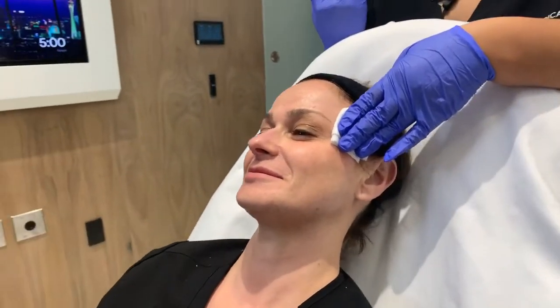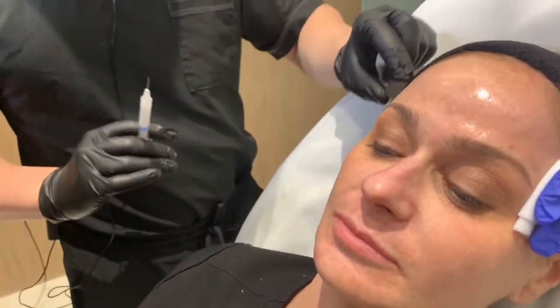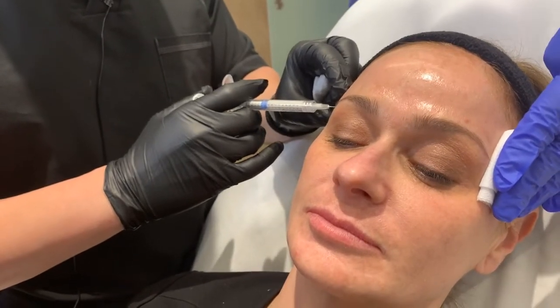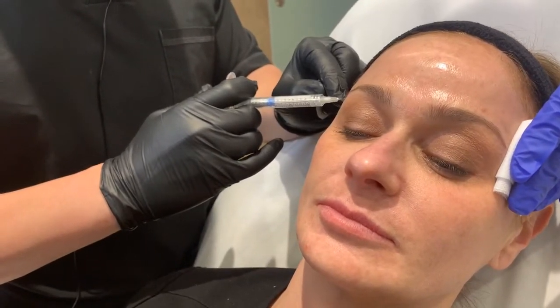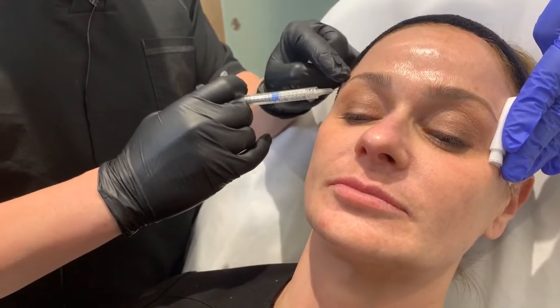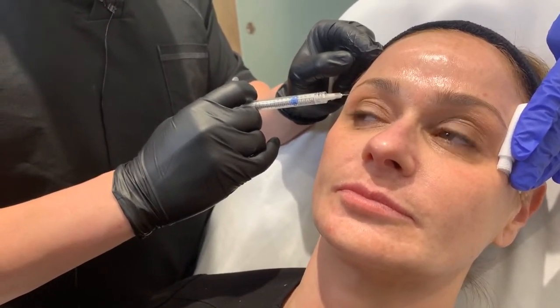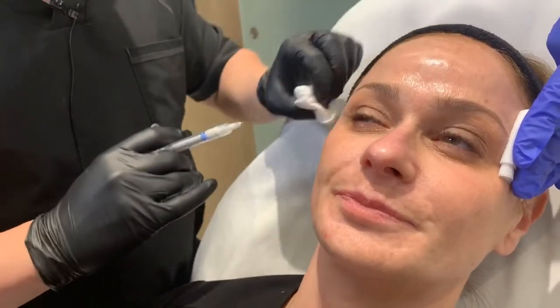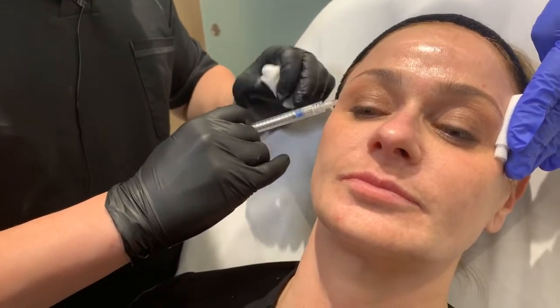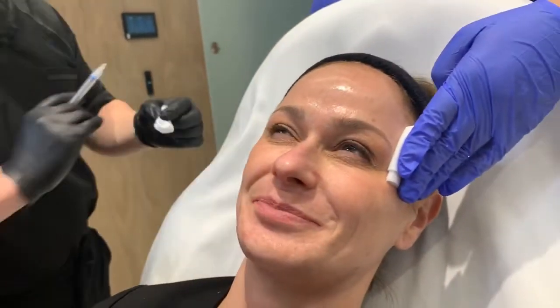Okay. So if we're teaching, you can see the ridge of the brow, you can see all the veins coming through here, and this space right here at the lateral edge of the brow typically has an area where you can easily go in. Again, remember, a superficial part, the needle's not as deep, going nice and slow. We're injecting in there. The only thing about it is that sometimes you hear it. So now we're gonna go a little lower, go deeper in the temple, and give a little more support. What do you hear? Crunching, right? It's crackling.